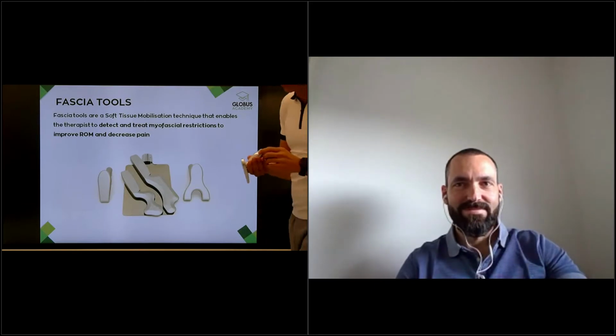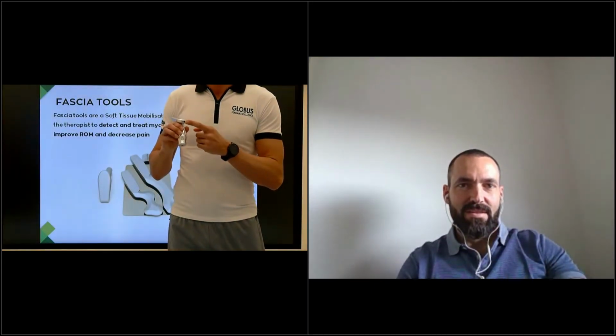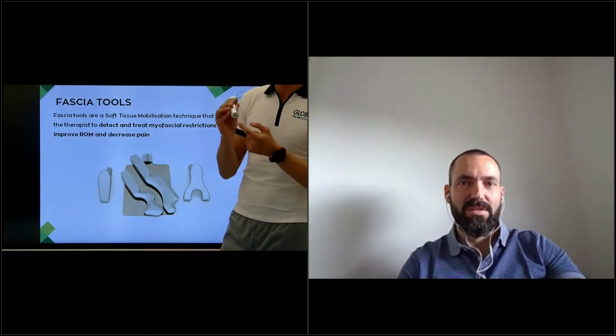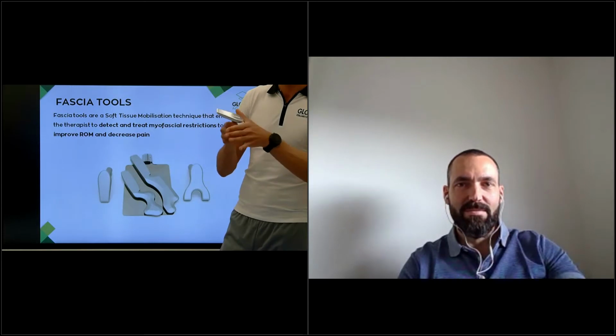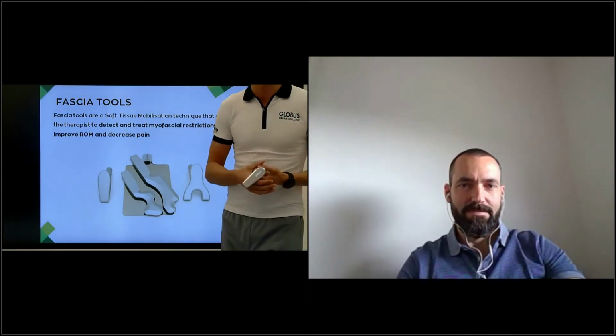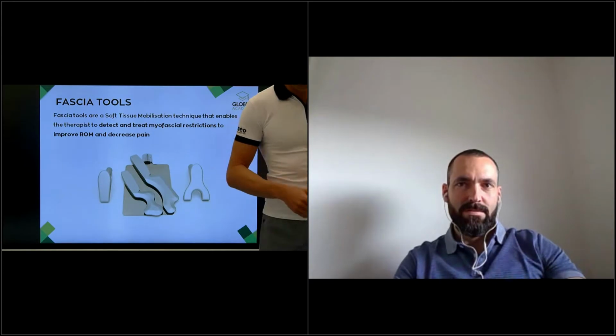Which hole are you using? The handle one or this one on the back? Yes, the handle one, because I can put more pressure. All right, so you need this area to be free for using your hands combined. Yes, and then I can go even deeper. That's right. Okay, thank you.